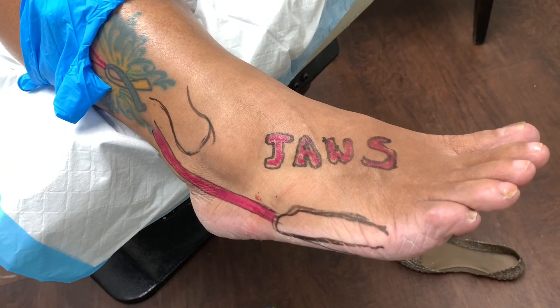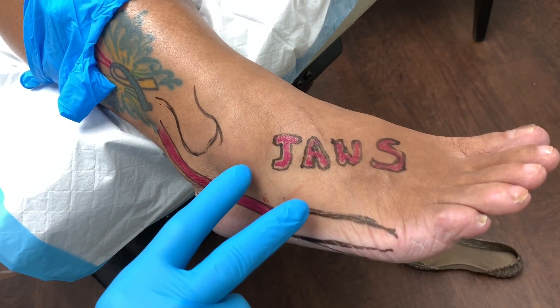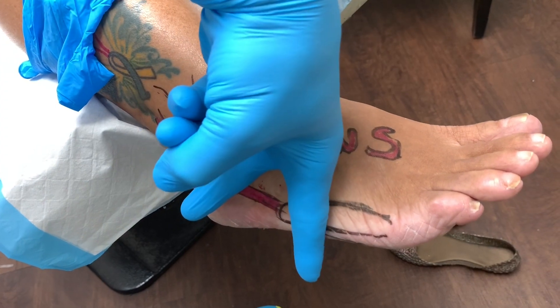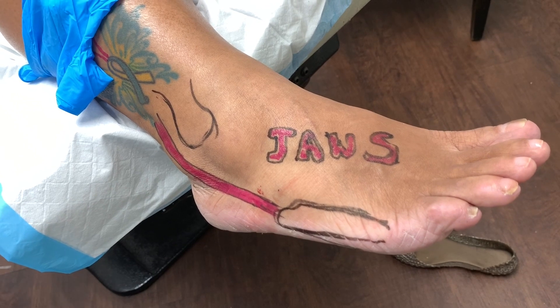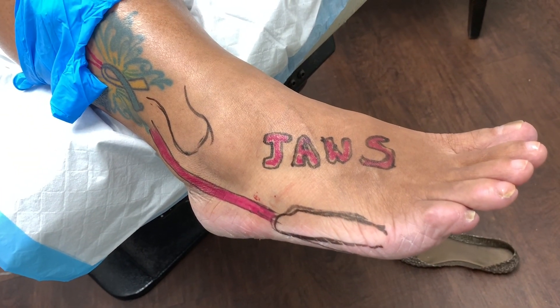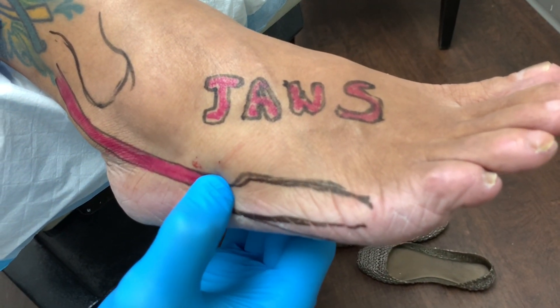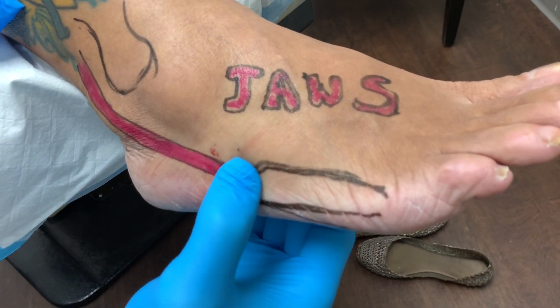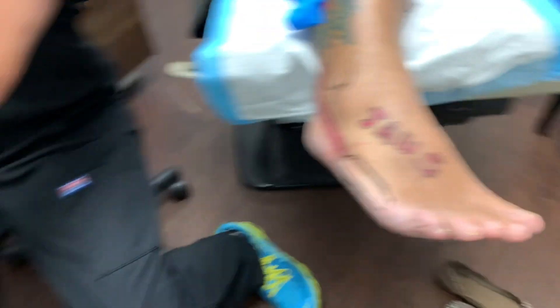I've said it in the past and I'll say it again — PRP is uncomfortable. We have already performed what we call a V-block. It's a V. Even when we perform these local nerve conduction blocks, there could still be pain involved in the procedure. When I was pressing here before, the patient had a lot of pain. Without further ado, we've demarcated the area. Ultrasound guidance is the key.